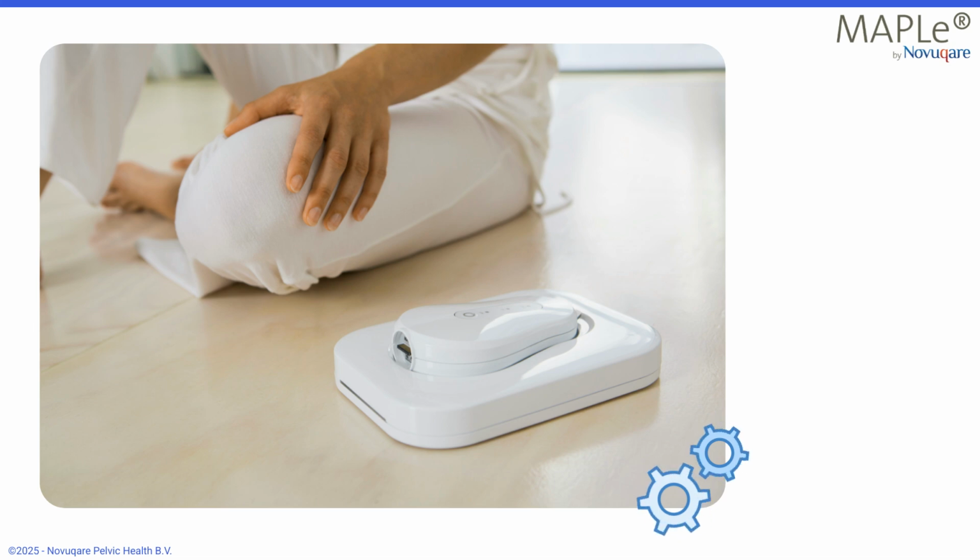Tips for effective ES use. Try the settings on yourself to understand how they feel. Observations during stimulation: slow and fast twitch, a vibrating sensation; thalamus stimulation, a pulsing sensation, avoid sharp pricking; gate control, a strong pressure sensation on the pelvic floor.